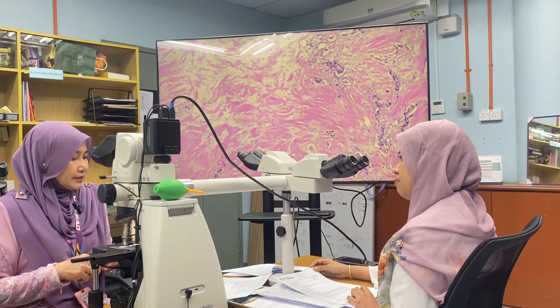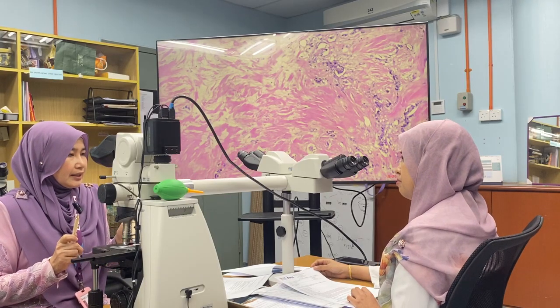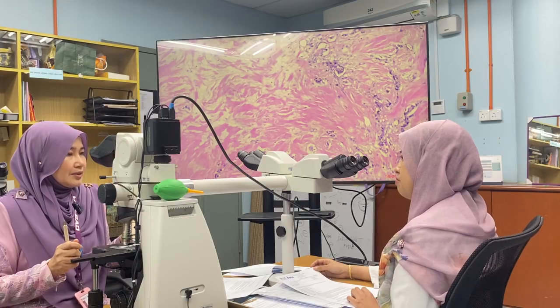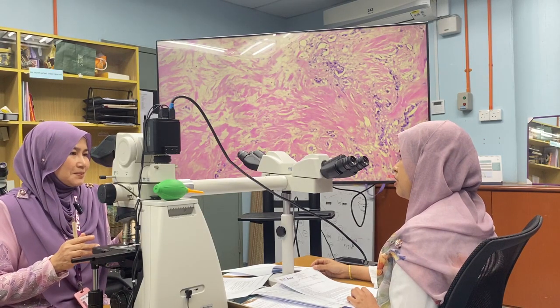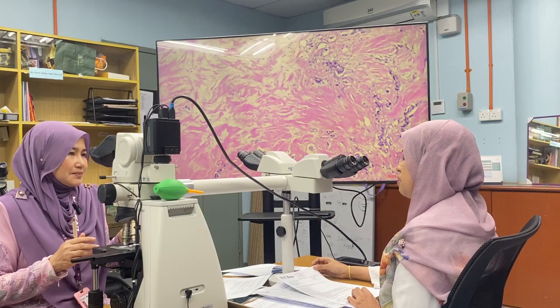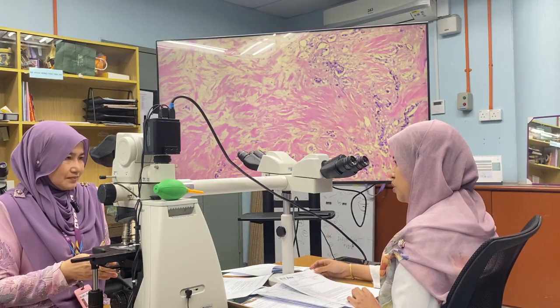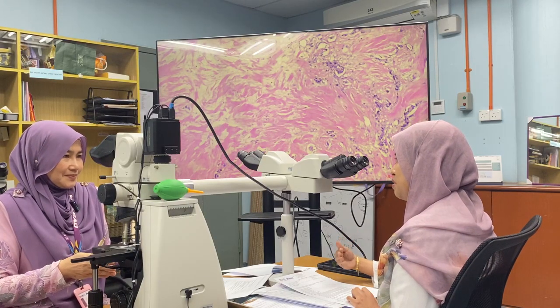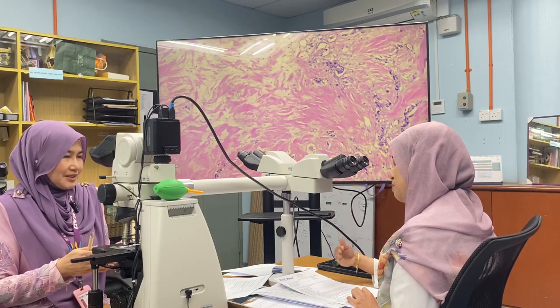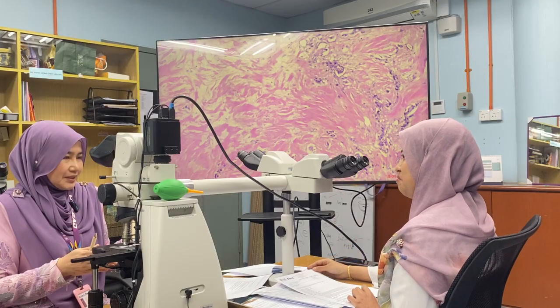The most important thing in post-neoadjuvant chemotherapy is to assess the tumor bed. Other than measuring the size, what else do we need to assess in the tumor bed? Okay, the tumor bed, as Prof said, is the size and also the fibrotic area around the tissue that correlates with the previous pre-chemo area.